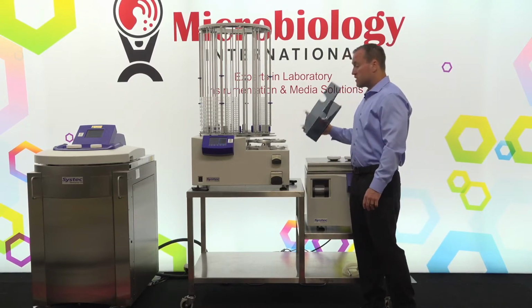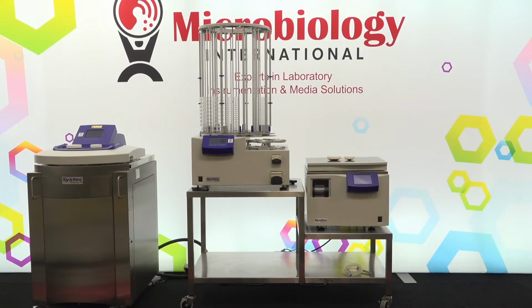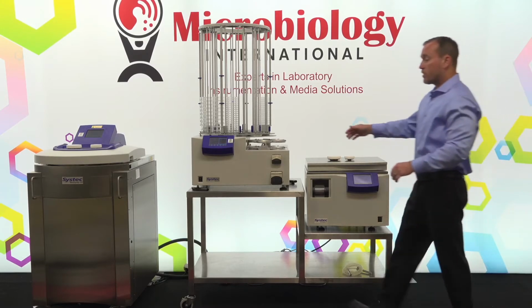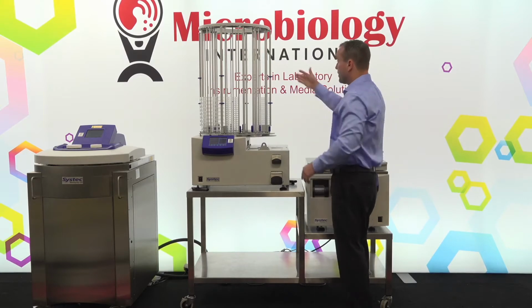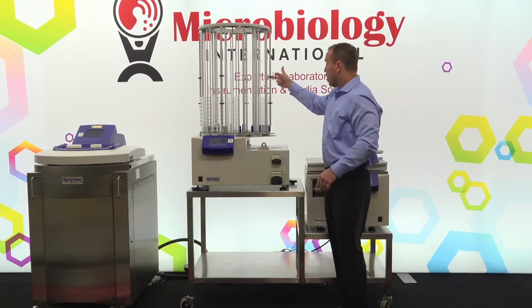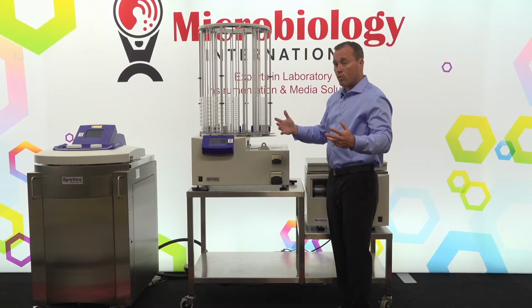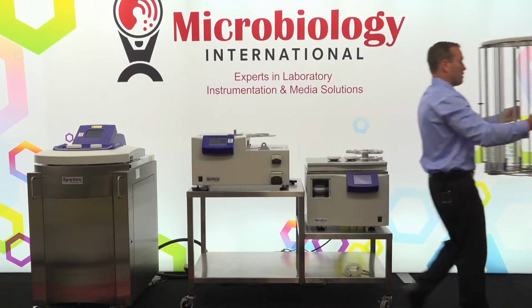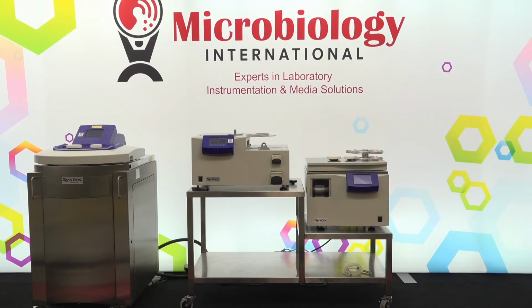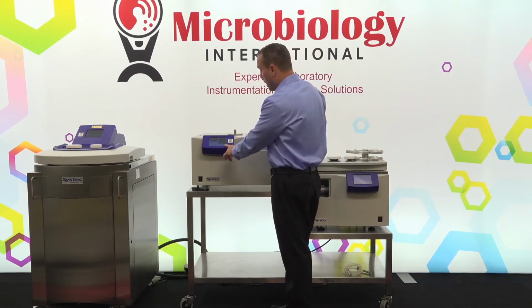So the lid is easily removed. The lid just comes off. The revolver can be removed out of the system. And then the carousel can be removed as well. There are areas on the outside of the carousel that are not the actual spindles that hold the plates into position for removal of this piece. So that simply just comes off. And now we can access any of the portions of this unit for cleaning.